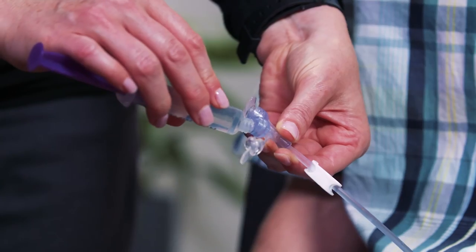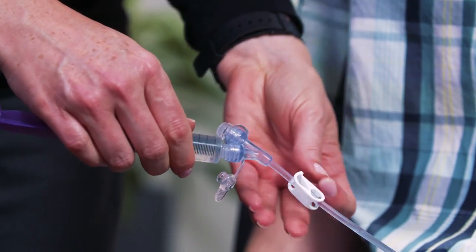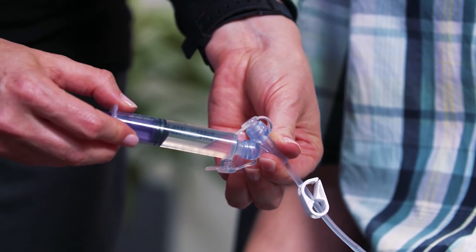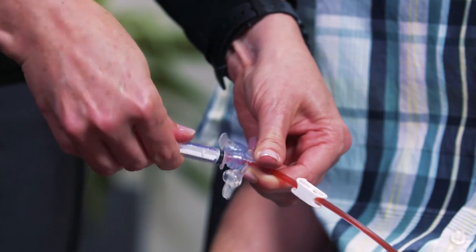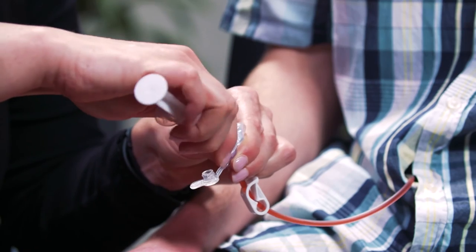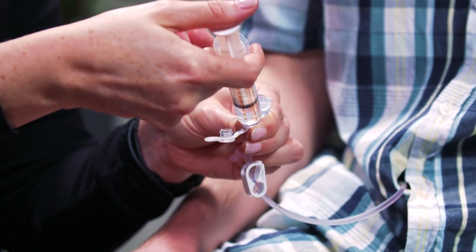Medication administration is simple with the INFIT system. First, twist the INFIT syringe into the INFIT medication port or feeding tube port after flushing the tube to make sure the tube is working properly. Next, gently push the syringe plunger to give the medication. After giving the medication, twist the syringe to unlock the connection. Finally, flush the medication port according to instructions, being sure the medication gets down the tube.